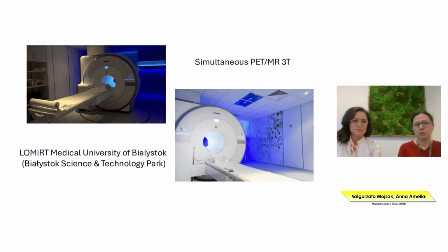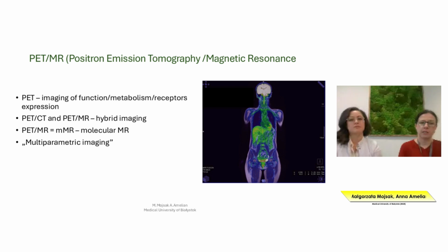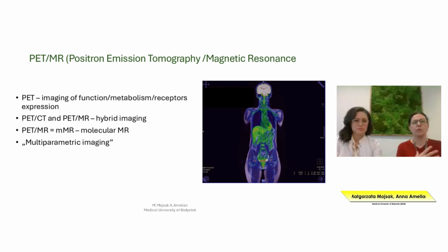PET-MR is not a refundable technology. We also teach students. So we deal with scientific and didactic activities. When it comes to PET-MR technology, just like PET-CT, this is a hybrid technique, as Professor was saying. So we've got two components.